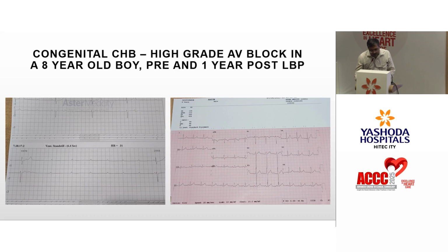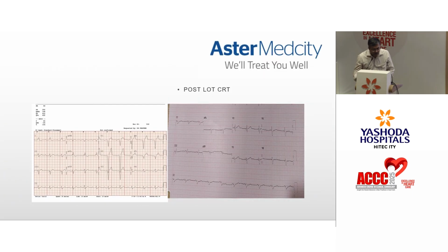The growth is well. The advantage of conduction system pacing in the pediatric population is that they may not have the growth deficit due to VVI pacing. So they may grow well. That's the advantage. And they will not have heart failure, especially in other congenital heart disease where heart failure is an associated thing along with the conduction system disturbance. So it's one of the applications at the extremes of age, young age and elderly.